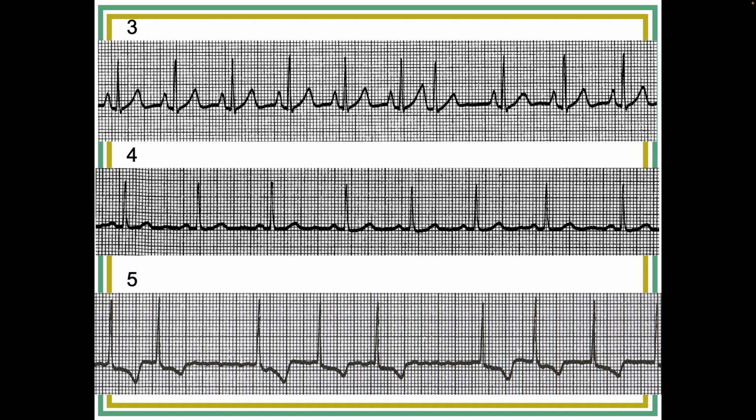Good. If you say it's a premature atrial complex, you're right if you're talking about that one. By the way, is there a P wave for the PAC? Not with the PAC, no. Is there supposed to be? Depends on the location of the ectopic foci. I think there is, and Andrew is convinced there is. Remember, look at the shape of the T wave. You can see it's bigger. So our best assumption is there's a buried P there.